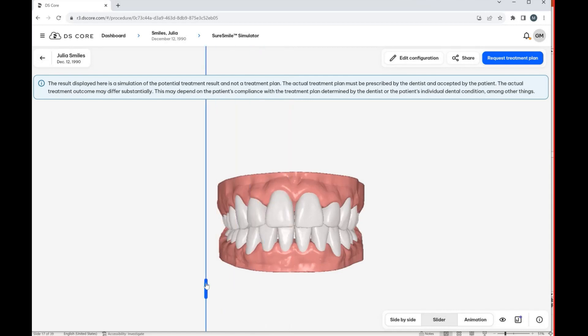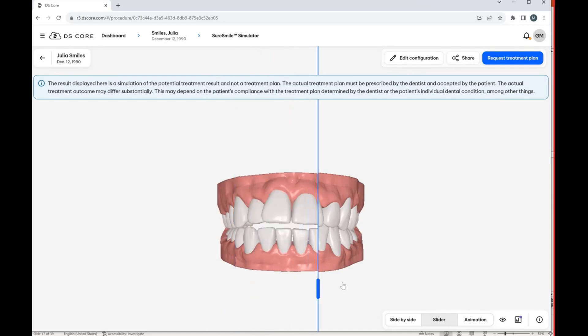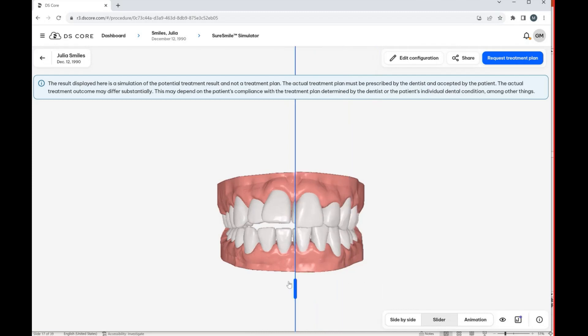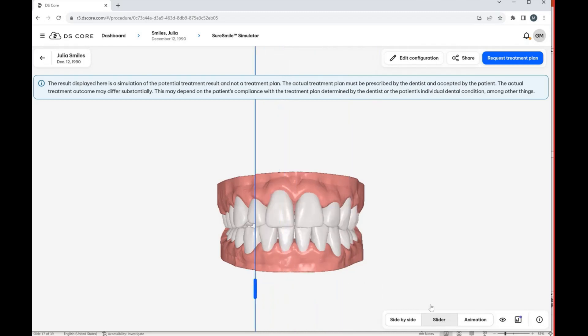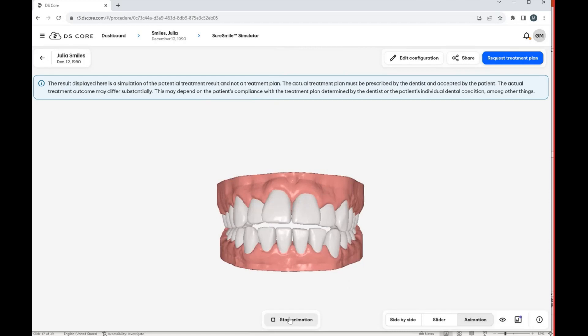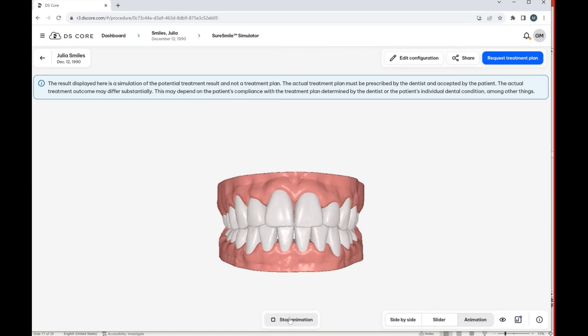which we just did, and then now the slider view to again show them what their treatment could look like. And then we also have the animation option. So we can basically play an animation of approximately what the treatment would look like.